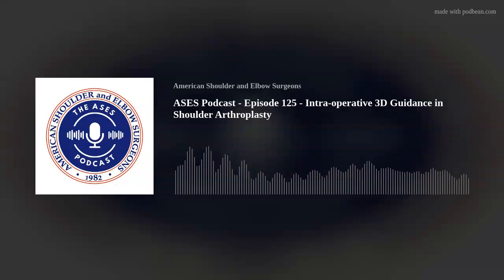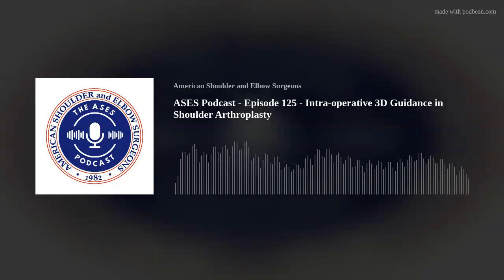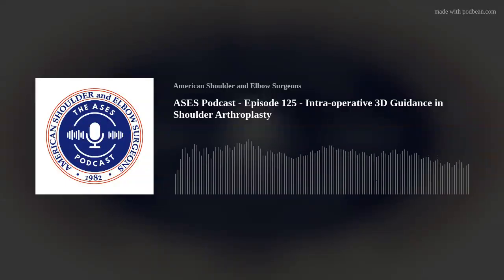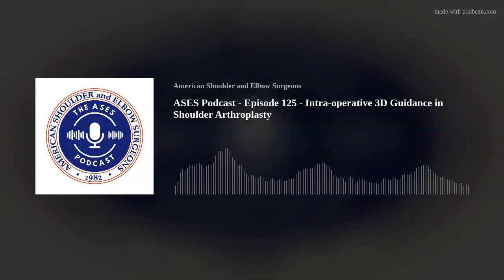What about you, Brad? Are you a plan every case guy, or are there some cases where you'll say radiographs alone are sufficient? I as well will plan every single case based on a 3D CT in some form of commercial software. In those rare cases that have metal artifact where the reconstruction fails, I will plan my version, inclination and augments based on corrections using a reformatted CT. As you've shown, to get more accurate version and inclination, you need to put it into the plane of the scapula along Friedman's line. That's my backup if the 3D planning software fails. But every single case, I go into the operating room with a plan ready to go.